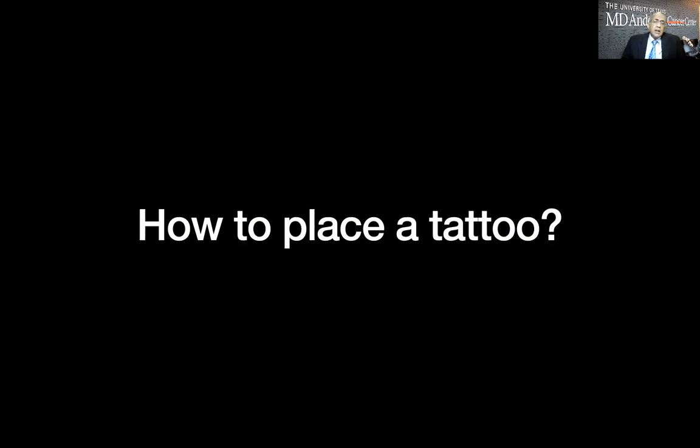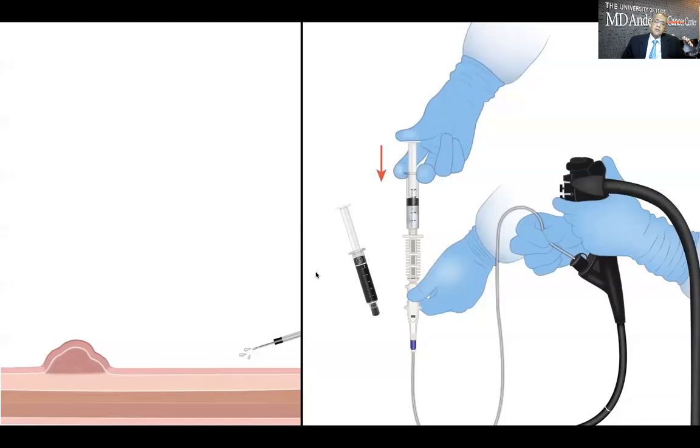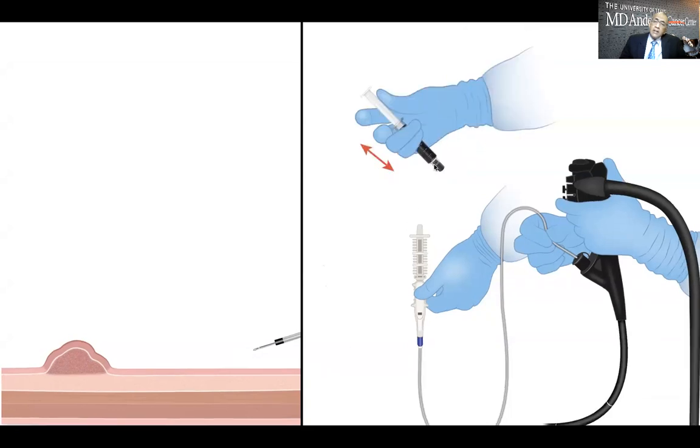So once you remove a large polyp, you need to come back for surveillance examination. And in order to find that, you have to place a tattoo. And how do you place a tattoo? I want to show you a technique that is well known. And I've asked my illustrator, Angela Deal, to draw it for you. If you have a needle that's not been used, the first step is you flush it with saline, and then use the SPOT or whatever tattoo that you use.